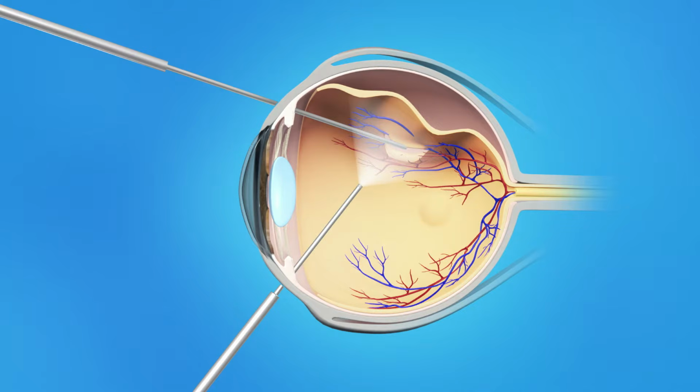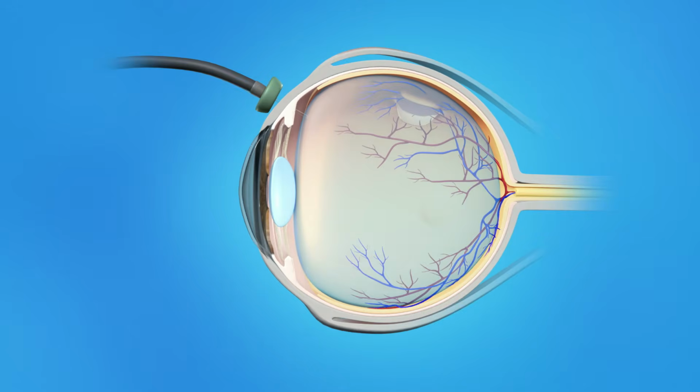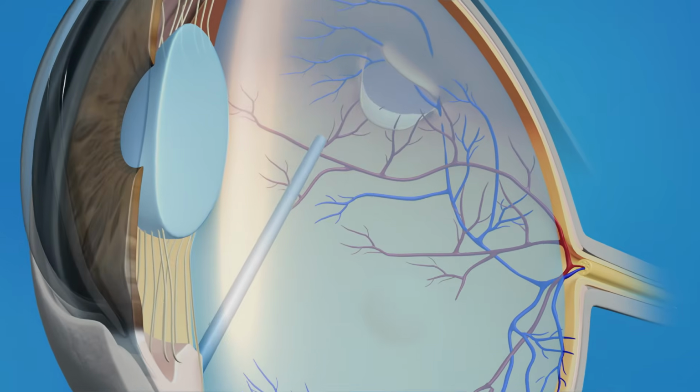Your ophthalmologist will repair your retina with a procedure called vitrectomy. The vitreous gel that is pulling on the retina will be removed from your eye and usually replaced with a gas or oil bubble to keep your retina in place to heal. This procedure is usually done in the operating room, and your eye surgeon will use either a local or general anesthesia. During a vitrectomy, your ophthalmologist makes a tiny incision in the sclera, or the white of the eye. A small instrument is placed into the eye to remove the vitreous gel. Once the vitreous is removed, your surgeon will inject a gas or silicone oil bubble in the eye to push the retina back against the wall of the eye. The tears and weak areas of the retina are then sealed with either a freezing probe or a laser treatment.